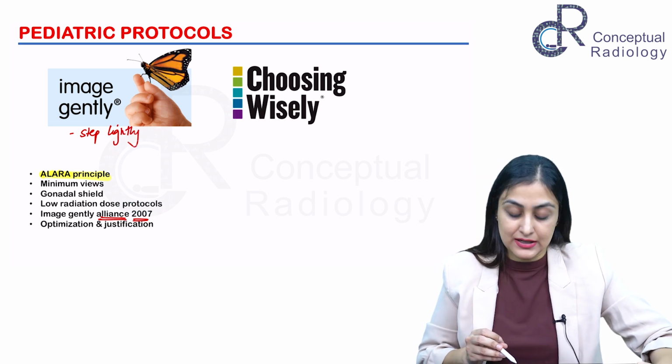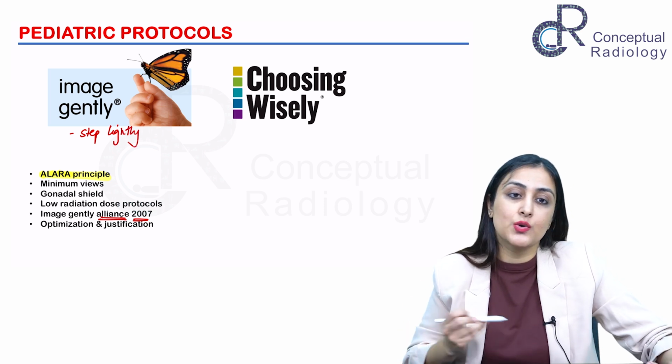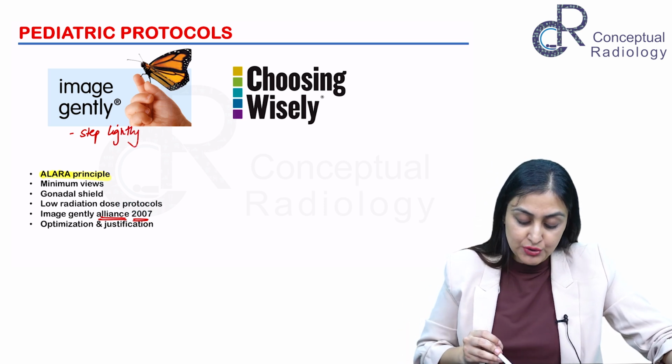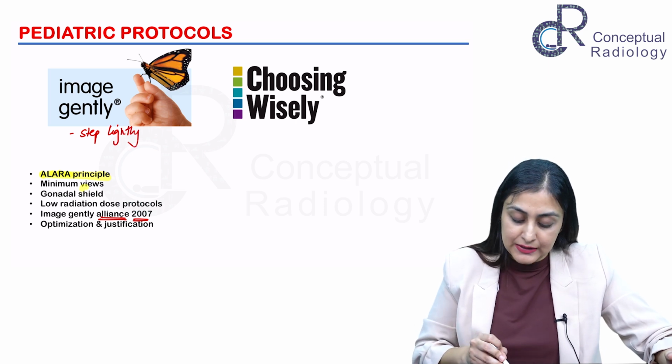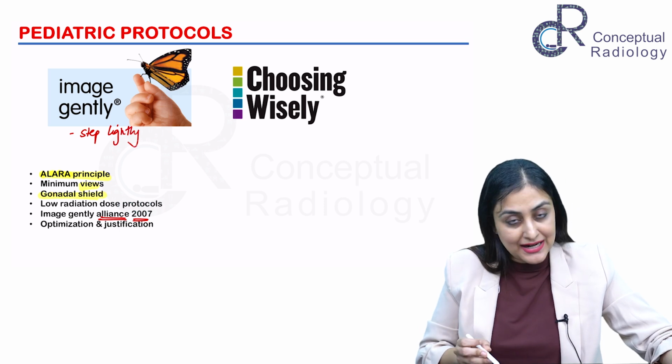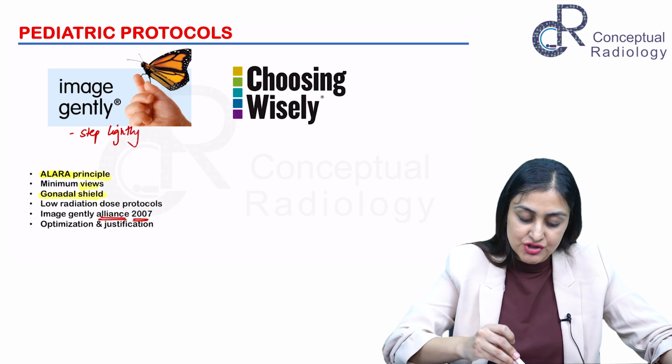So this is a short note in itself. Pediatric dose optimization is a question in itself. You want to take minimum views. So these are the bullet points you want to keep in mind. ALARA. Then you want to take minimal views. Use gonadal shield in X-rays all the time. You have to use lower radiation dose protocols.